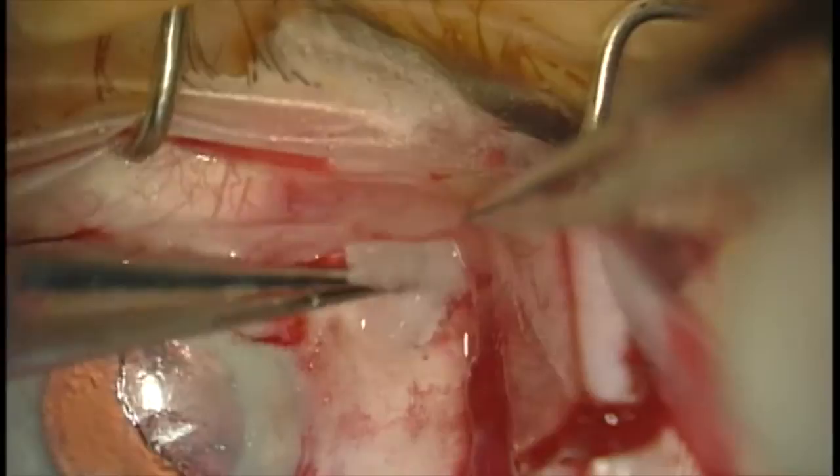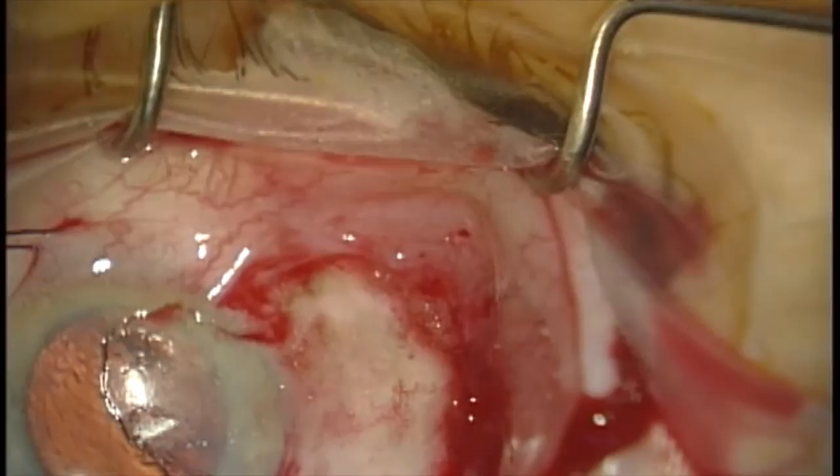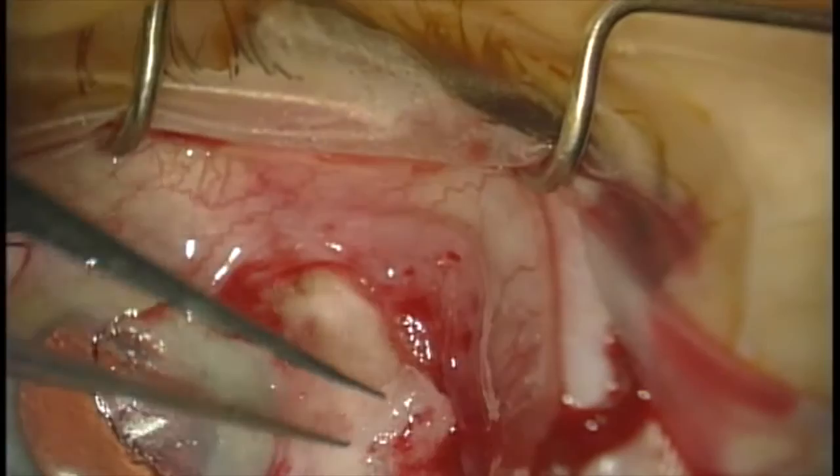Gentle cautery is then performed to obtain hemostasis. Now we're going to use mitomycin C 0.02% soaked on Weck-cel sponges and treat the cut edges of the conjunctiva for approximately one minute.